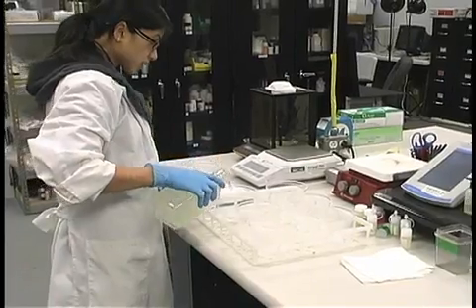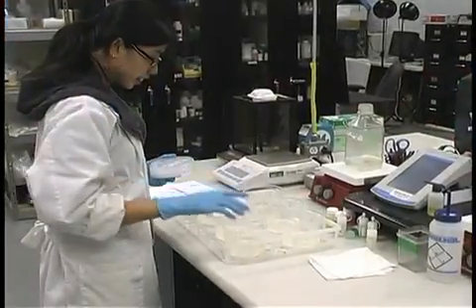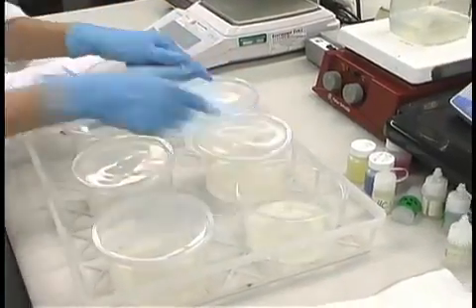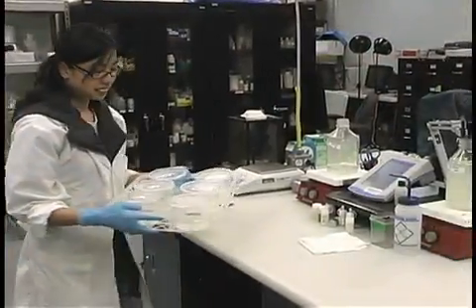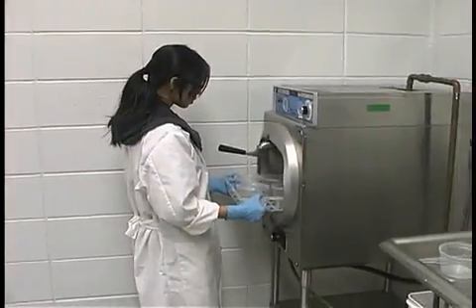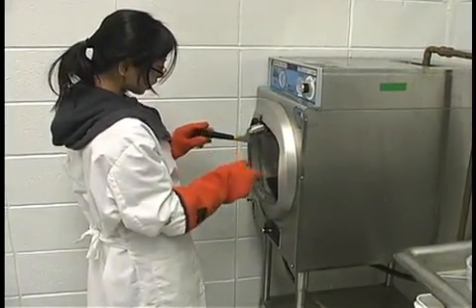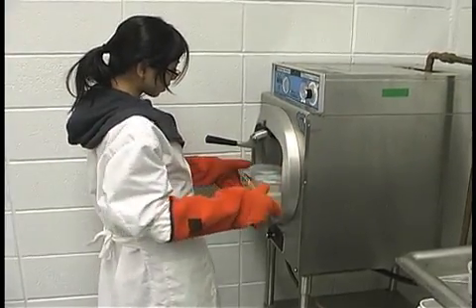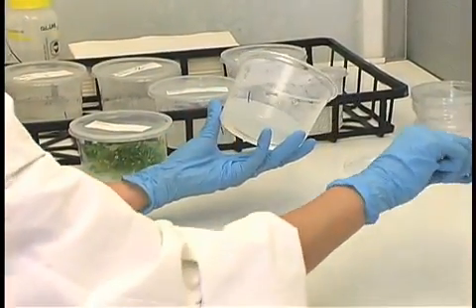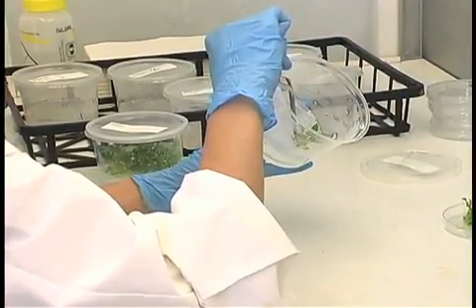If you are using autoclavable culture vessels such as glass jars, phytocons, or magenta boxes, dispense the medium into the culture vessels prior to autoclaving. The culture medium will need to be sterilized to kill any contaminants. This is done using either an autoclave or pressure cooker. Sterilize the medium at 1 kilogram per centimeter squared or 15 psi, which is 121 degrees C, for at least 15 minutes. For larger culture vessels, you may need to increase the time for sterilization. Allow the medium to cool for 30 minutes to two hours until the gelling agent has properly solidified.